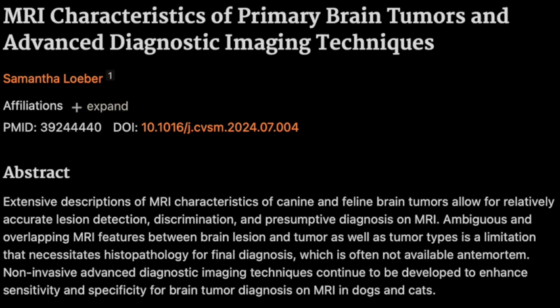Oh no. So these tumor cells can travel to other parts of the brain? That's right, and even the spinal cord. We call it drop metastasis, and it's this feature that helps us tell the difference between choroid plexus papillomas, which are benign and slow-growing, and choroid plexus carcinomas, which are malignant and much more likely to spread. So that's not good. No, not so much. Understanding these features on an MRI is super important for figuring out how bad it is and planning the best treatment strategy. Wow, this is a lot to take in.